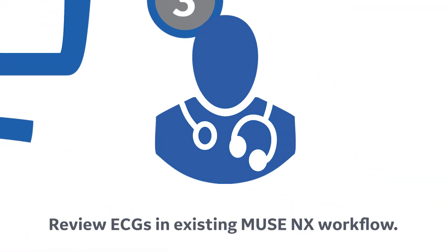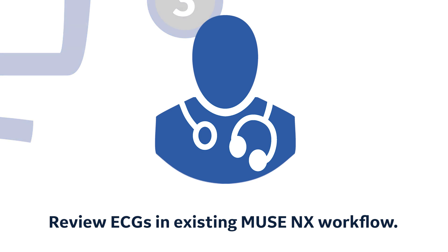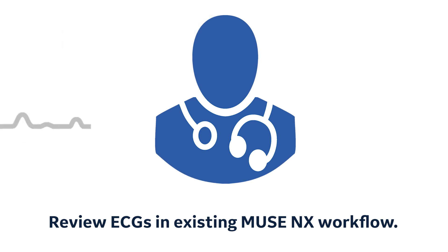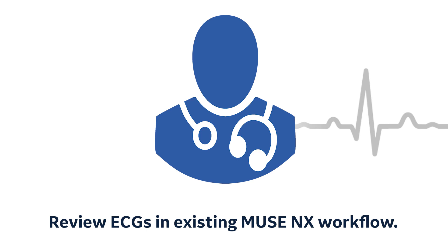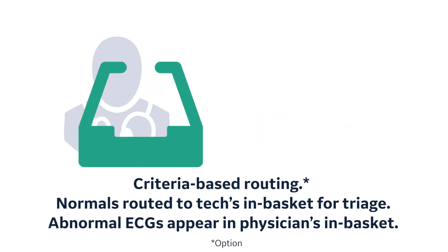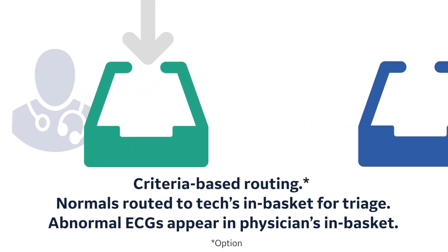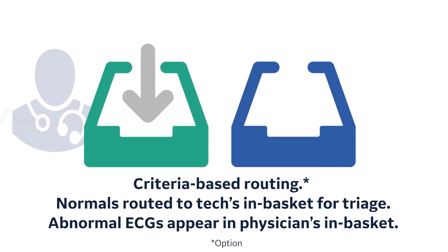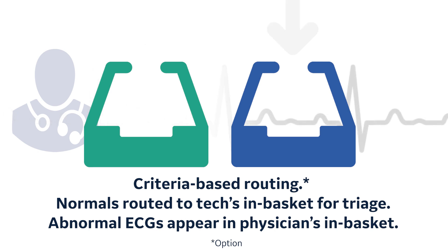Muse NX shows the 6-lead ECG data in a way that's similar to your existing 12-lead ECG workflow. Prioritize incoming mobile ECGs quickly with criteria-based routing to manage the data more efficiently.